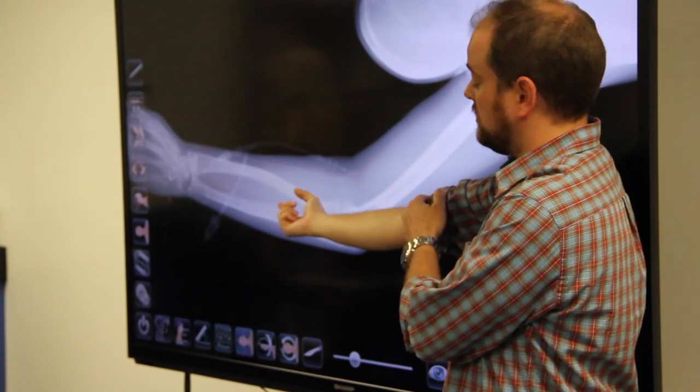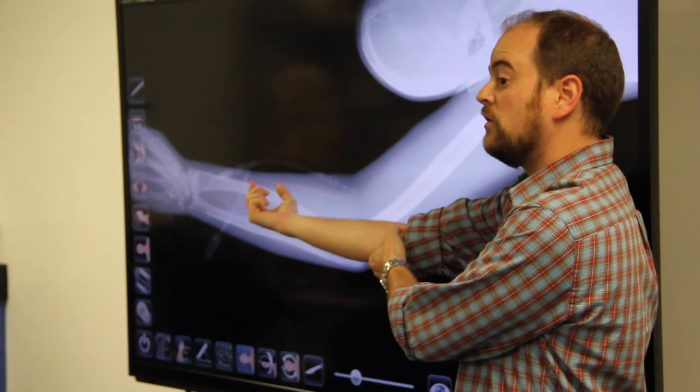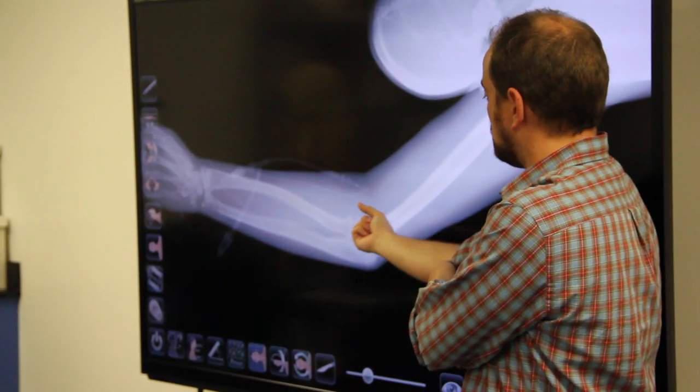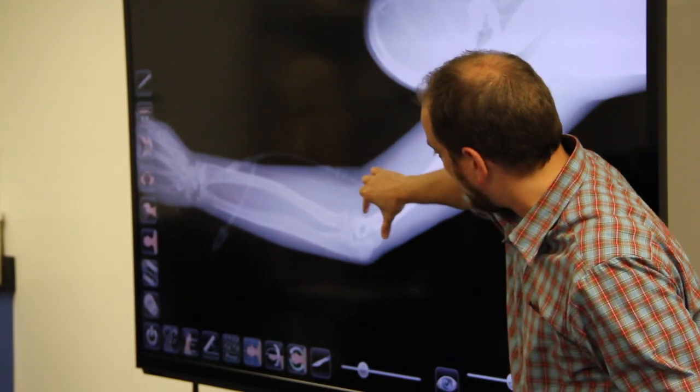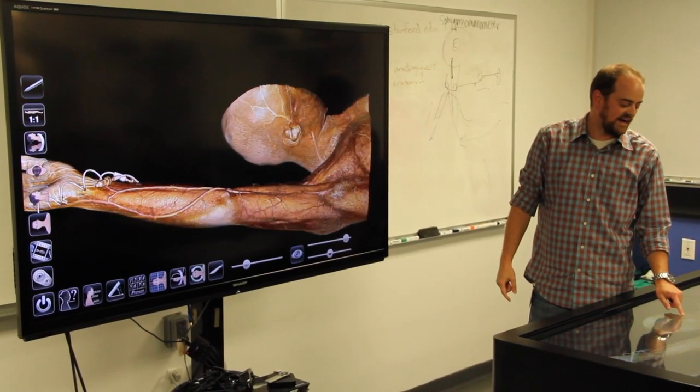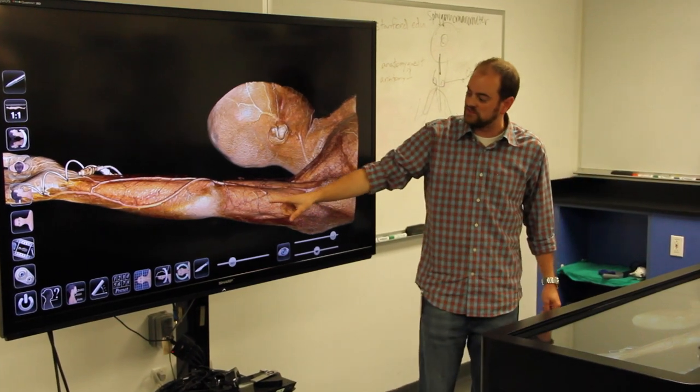What's going to limit flexion is when the opposite end, the coronoid process of the ulna, sits in the coronoid fossa. But you can see here that there's an actual, if we follow the attachment of the triceps distally.